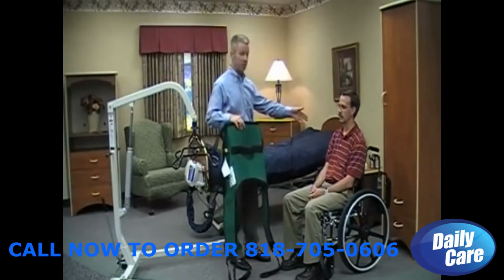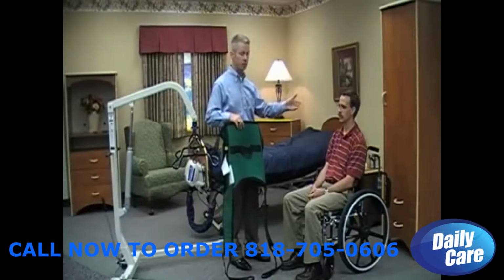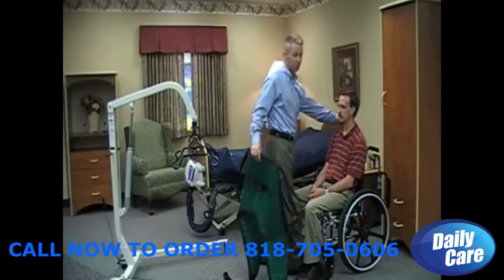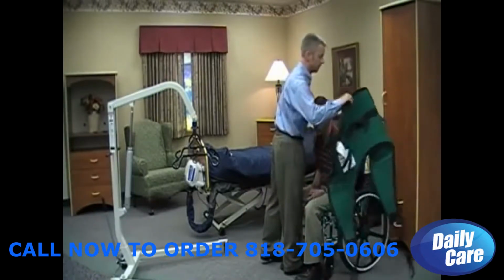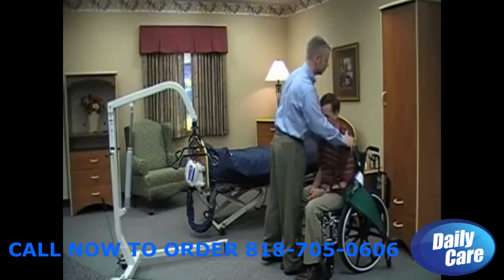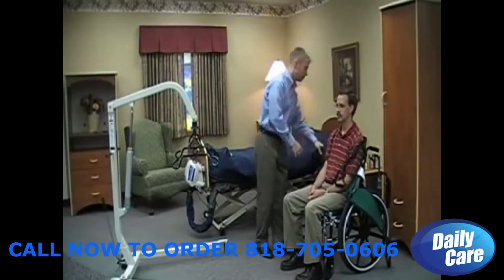And I'll approach the resident and tell them the transfer I'm going to do or what the process is going to be. And I will put my right foot between theirs or my left foot between theirs and lean them forward to me. From there, I'm going to fit that sling behind the resident, tucking it down until it's in a comfortable position, and then pushing them back on top of it.